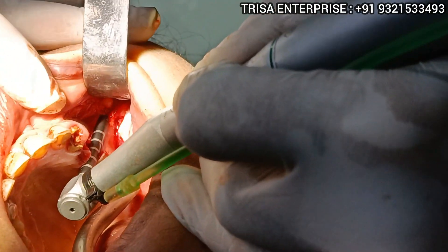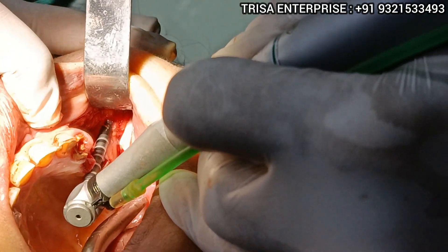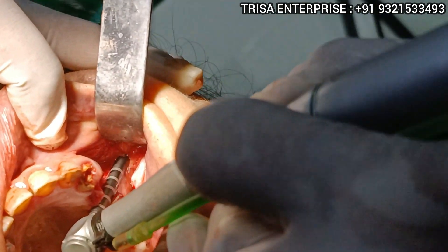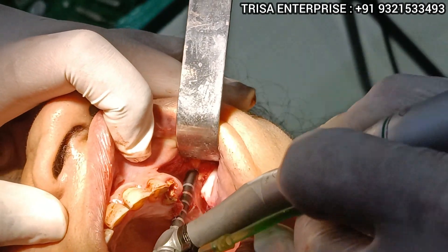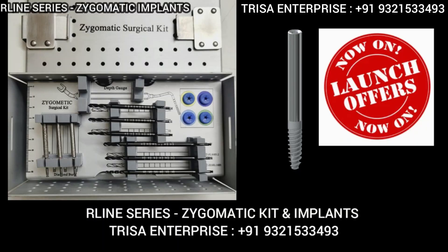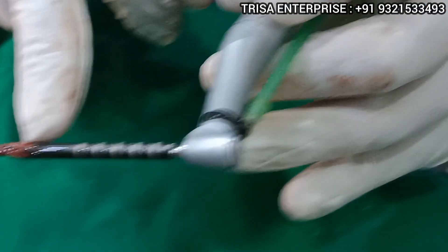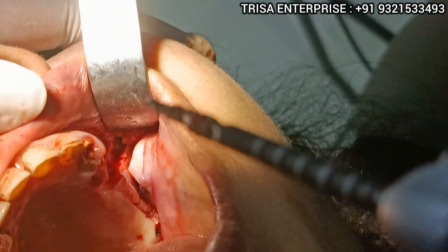I'm at 45. The fact that I have got clean bone — you can see there is nice clean bone in the anatomy and not much bleeding — indicates to me that I have hit the zygomatic bone, along with the nice torque which I felt when I was drilling.